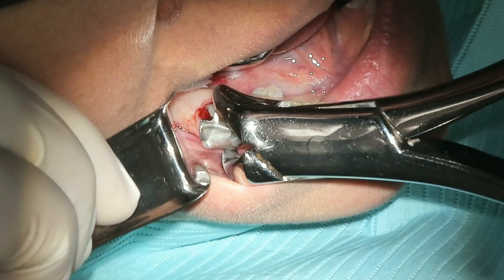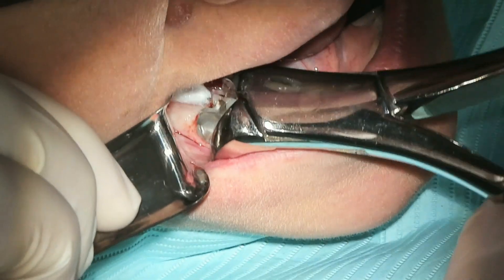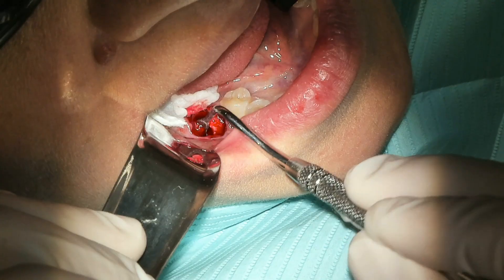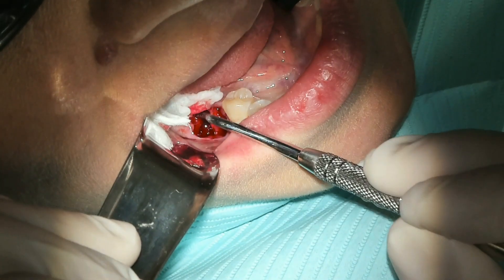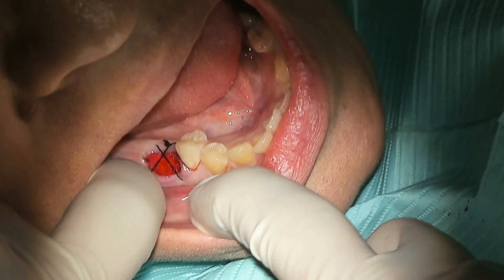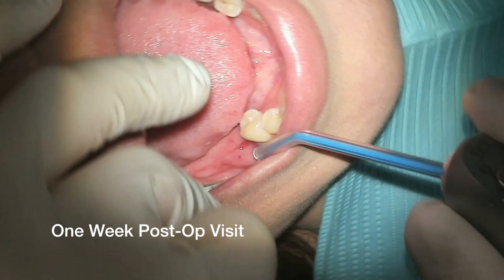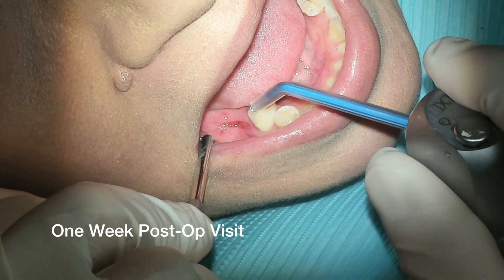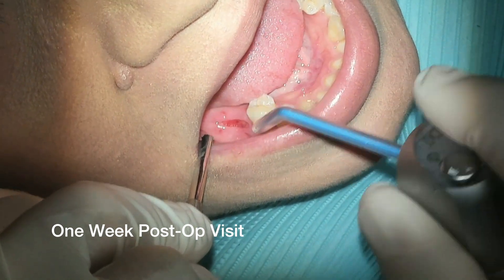Here we had just the right amount of bone loss to where we could get the cow horn forceps into the furcation and actually squeeze a little bit and cause that root structure to elevate up out of the bone socket. Realistically, you really could have just used the 151 universal for the lowers because of so much bone loss occurring there — it would have been very simple as well.